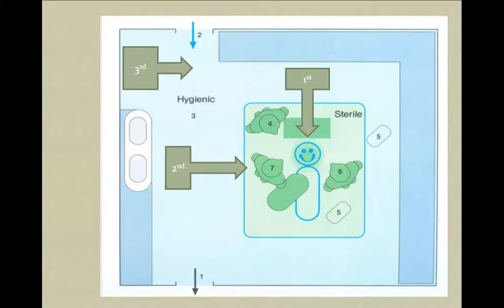You will ask the circulating nurse to open a sterile implant and give it to you in sterile fashion, because implants should be transferred from the hygienic zone to the sterile zone in sterile fashion. Therefore, except the patient, you need minimum 3, maximum 4 persons in this room: 3 if you don't need an assisting nurse, 4 if you need an assisting nurse, plus the circulating nurse.